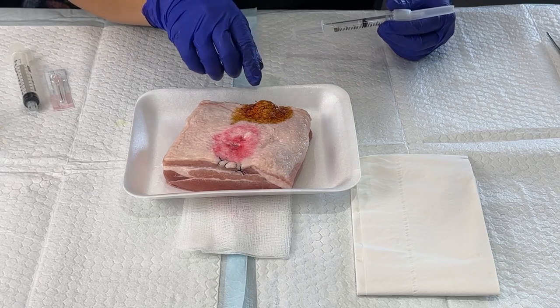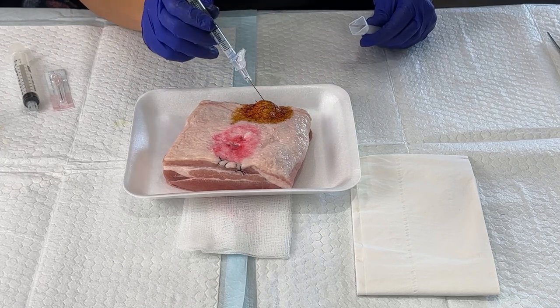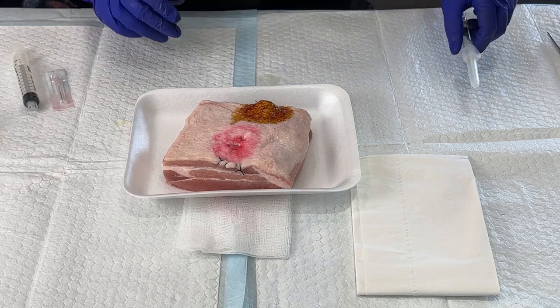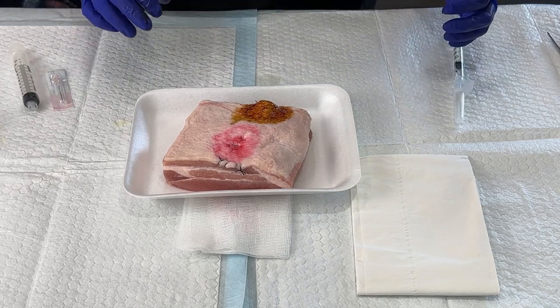Give it time to sit in and then ask the patient if they can feel that before you get started. Some patients elect to just have the procedure without the anesthesia.